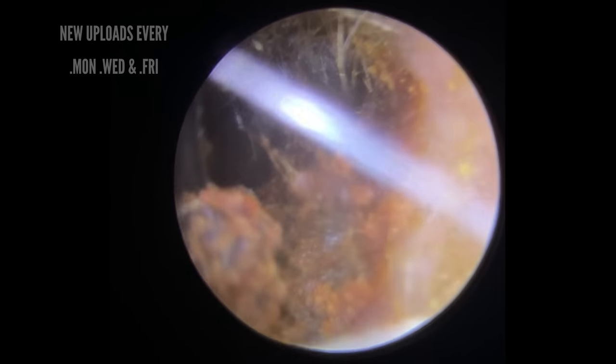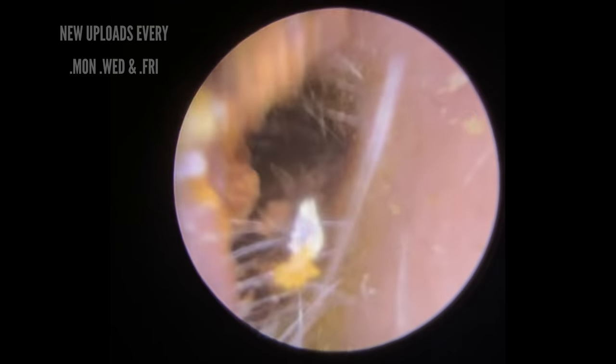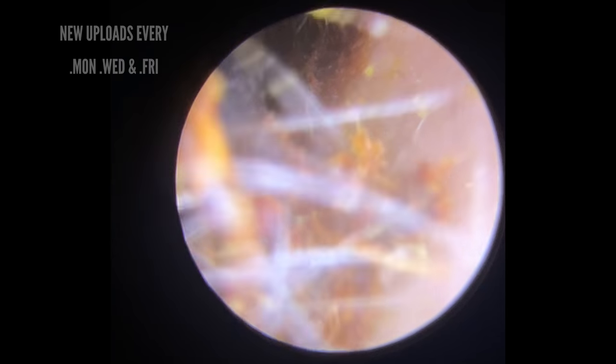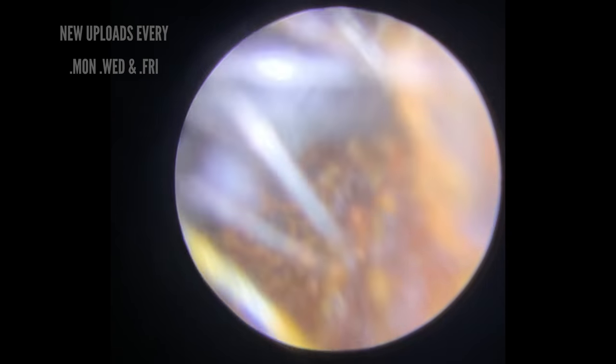As we put the Jobson horn in, I'm trying to work over the chunk of wax, but I just can't get over the top of it. It's so big and so firmly stuck to all canal walls that we're just having to take a chunk out of the front of this. You can see the little groove being made continuously by the Jobson horn. So we're taking this central core away, and the plan is to try and fold the two sides into that core to unstick them — because at the moment it's so firmly stuck all the way around the outside edge, which is why we're not getting a lot of movement.